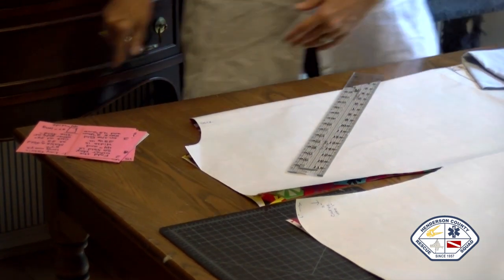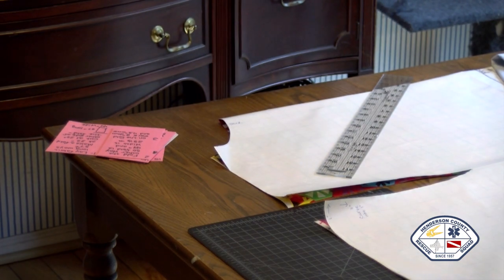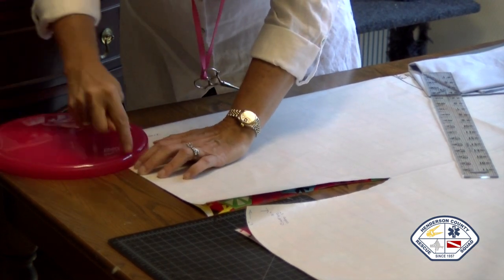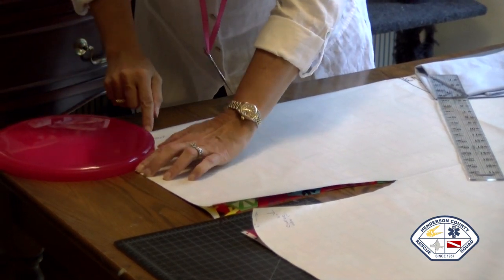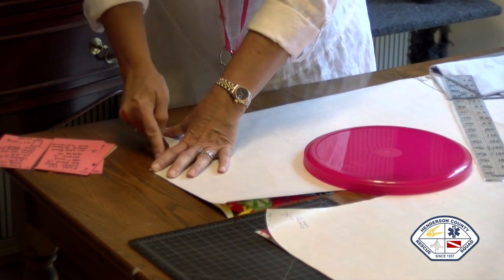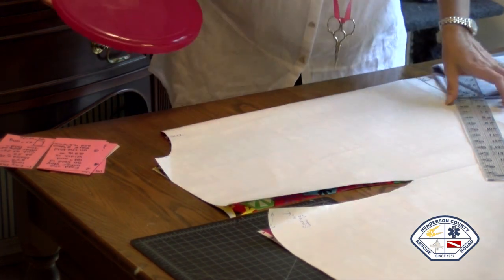What I'm going to use is a plate. And I placed my plate on my marks. 4.5 inches across, 3 inches down. Draw a line, and you've got a perfect neckline. Excellent.